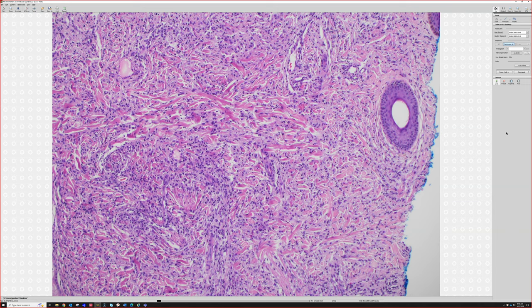Sometimes they're histiocyte predominant, with little foam, sometimes they have a bunch of foam, sometimes they have a lot of lymphocytes, sometimes they have numerous EOs, sometimes they have just sheets of Touton giant cells. Any of those combinations are fine. Sometimes they become very fibrotic and start looking like dermatofibroma. So if you think it's a DF, but you start seeing EOs and Touton cells and it's the face of a kid, probably xanthogranuloma. If you think it looks like a xanthoma, but it's got areas with a lot more lymphs and some EOs, probably a xanthogranuloma.